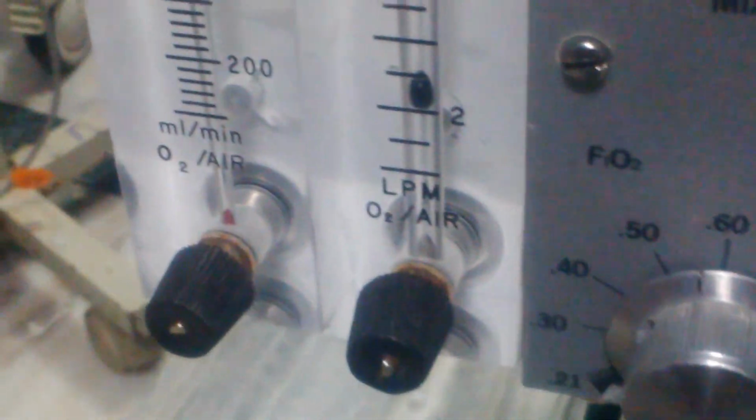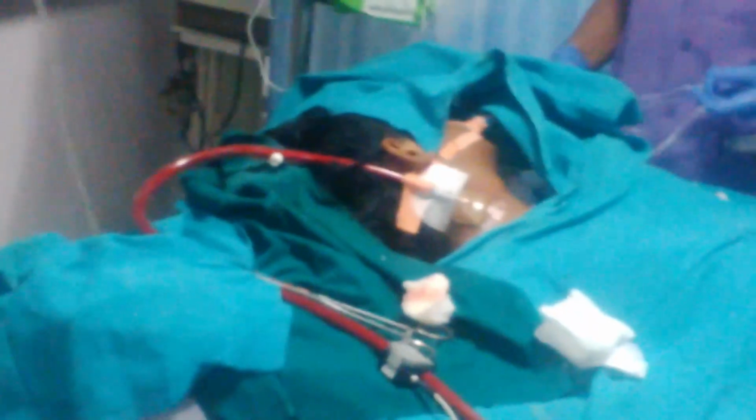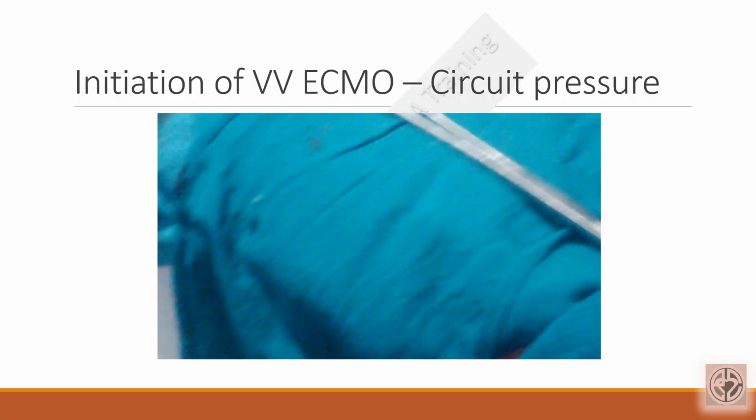And we have one more line where we connect both P2 and P3 together, and we can rotate the knob. Or you can connect P1, P2, P3, all three together with the help of three-way stopcocks. Just keep P1 as continuous monitoring, and check P2 and P3 hourly, and thereby you can check the delta pressures.